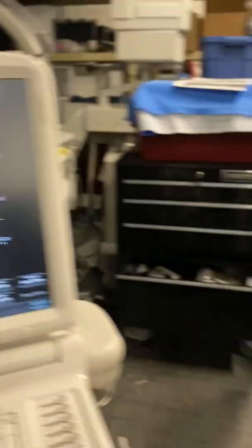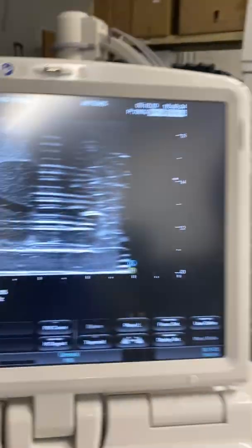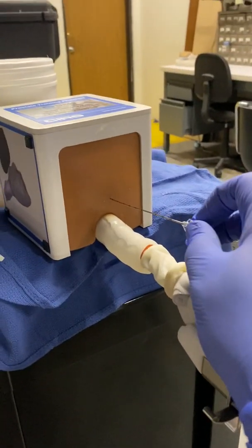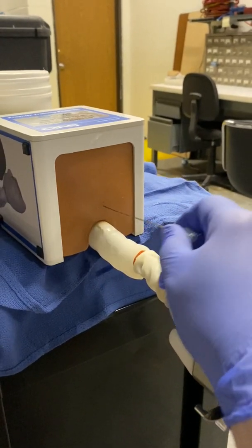You'll see them put the kit together and screw it onto the end of the needle. Once they're screwing it in to the needle, they try to hold the needle still to prevent it from moving.